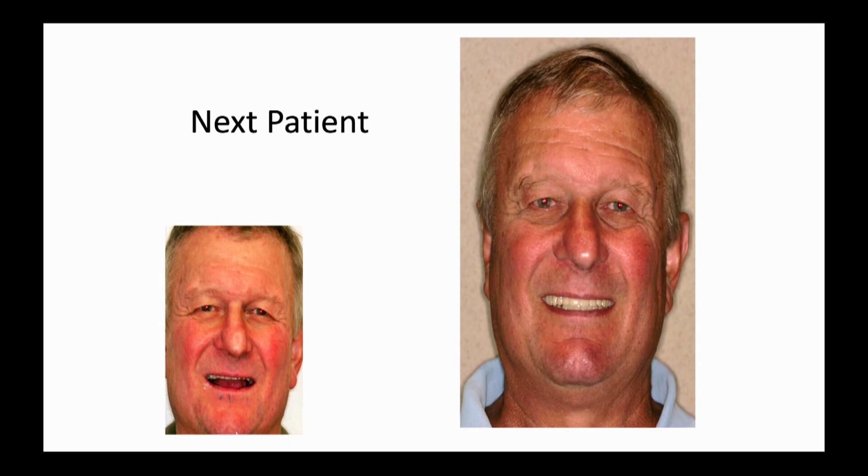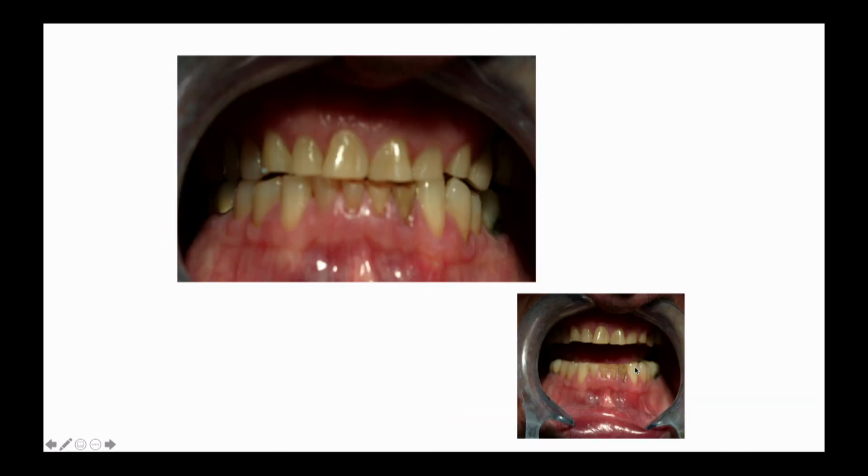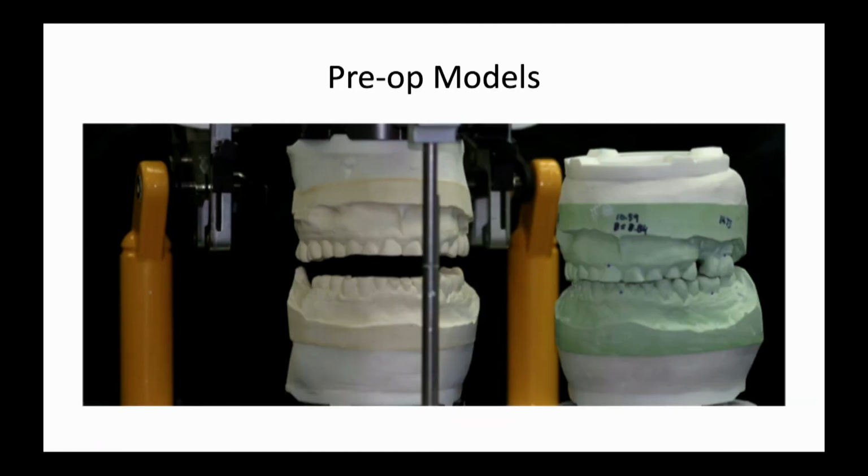Well, let's look at the next patient. Same thing. When this guy smiles, he shows no teeth. We want to restore him in temporaries with that and then take that into final restoration. So that's where we started. That's his position that we're trying to duplicate. So we went from really short teeth to a lot longer teeth. We don't have to reduce the height of these teeth. We want to add to them. So again, how do you routinely transfer that? You can see how you do it.